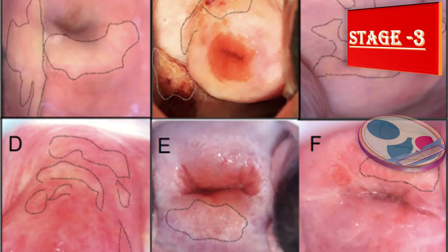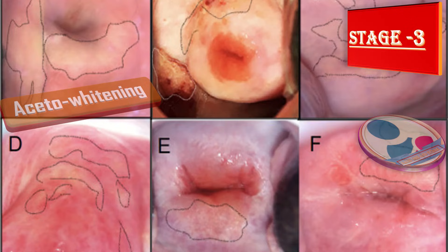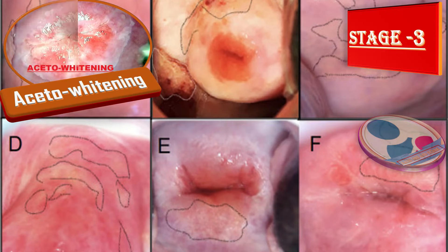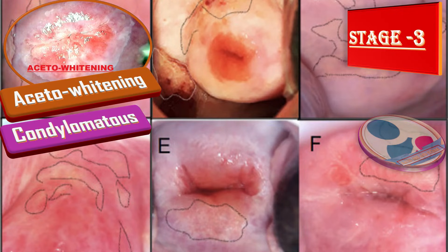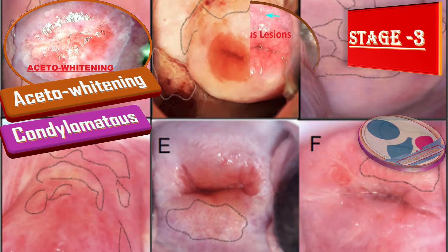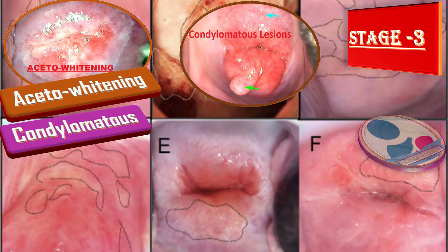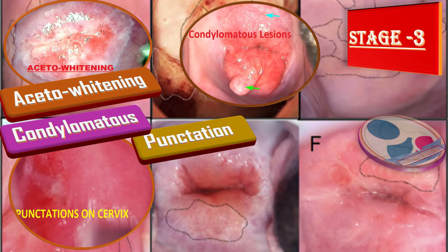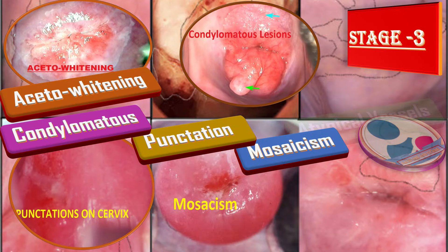Stage three of the colposcopy procedure involves grading of lesions. We check lesion margin and color, looking for aceto-whitening like leukoplakia, white areas of thickened epithelium, and condylomatous changes such as frondy, micropapillary, feathery, and satellite lesions. When checking the vascular pattern, we look for punctation, mosaicism, and atypical vessels.